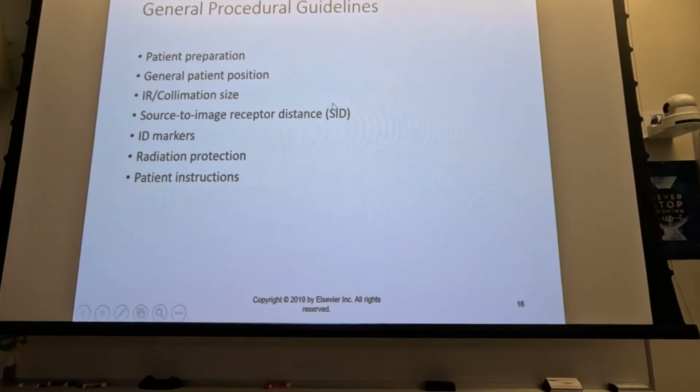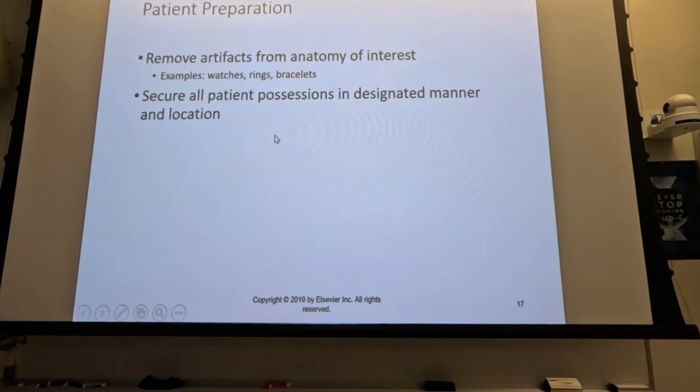So SID, unless I specifically tell you a different SID for a specific projection, assume that everything is going to be at 40 inches. Make sure you use your marker, radiation protection, primarily your collimation, and then patient instructions, just be still in most cases.